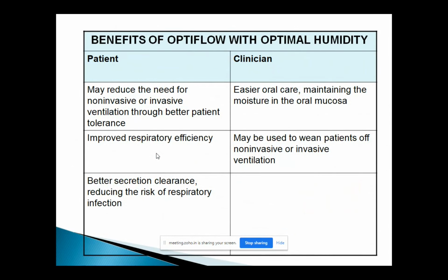Patient advantages again: it may reduce the need for non-invasive or invasive ventilation. On so many occasions, in my personal experience, patients looked very unwell and we thought the patient may have to go to the intensive care unit for non-invasive ventilation or even intubation. So many patients made a huge successful recovery with this device, with this type of oxygen delivery system. Obviously, I'm not saying 100% recovery. I have seen the maximum number of patients making a good recovery, but a few patients, unfortunately, because of their underlying conditions, are not that well, and they need to be escalated.